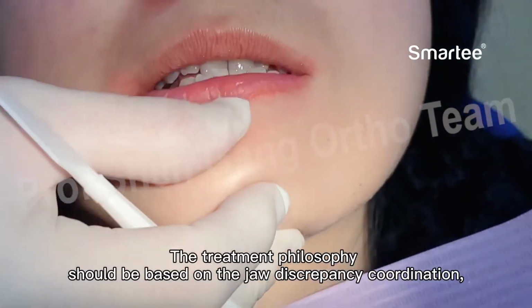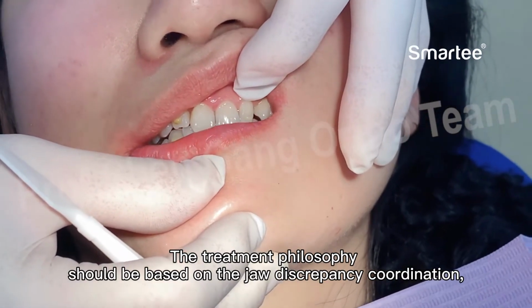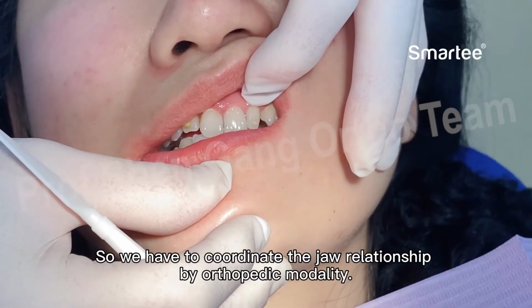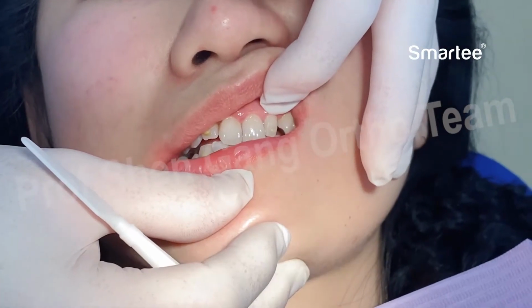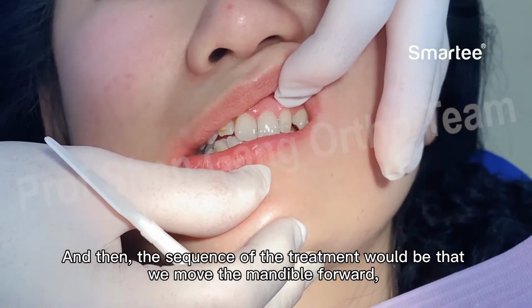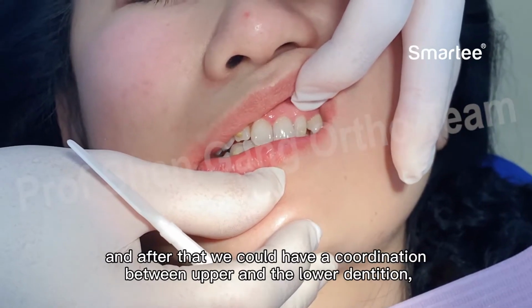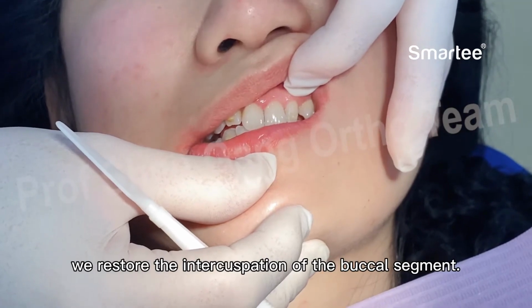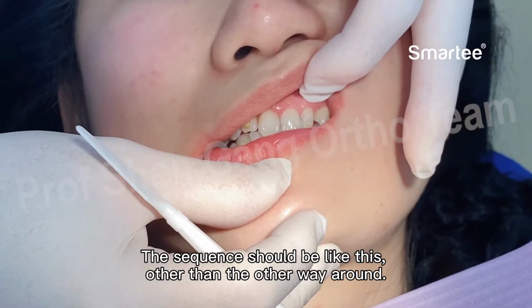Treatment philosophy should be based on coordinating the jaw discrepancy rather than correcting the teeth first. So we have to coordinate the jaw relationship by orthopedic modality, and the sequence of the treatment would be that we move the mandible forward and retract the maxilla backward, and after that we could have a coordination between the upper and the lower dentition. We restore the intercuspation of the buccal segment. The sequence should be like that, and not the other way around.